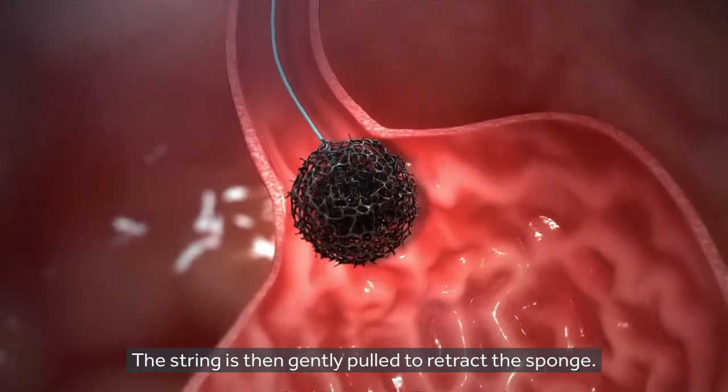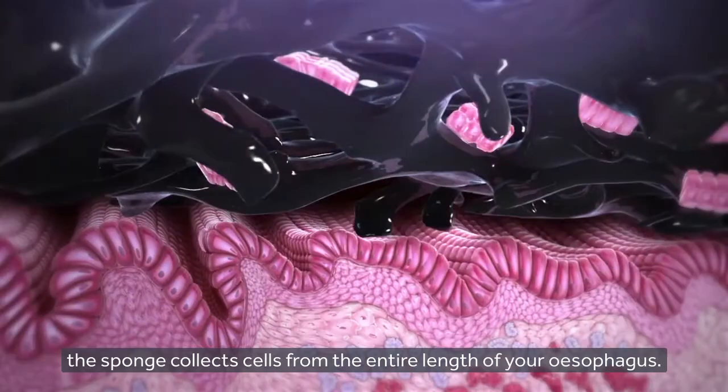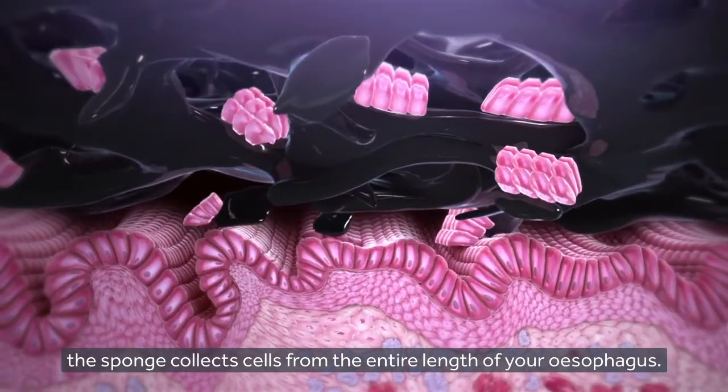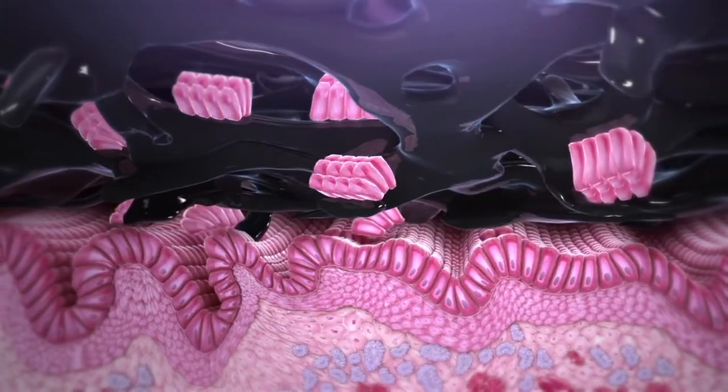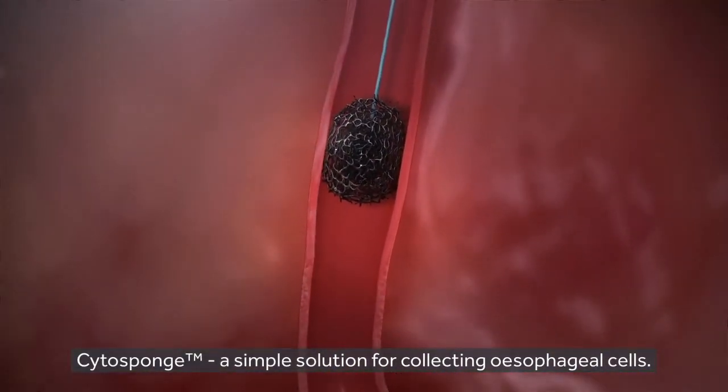The string is then gently pulled to retract the sponge. As it's retracted, the sponge collects cells from the entire length of your oesophagus. Cytosponge — a simple solution for collecting oesophageal cells.